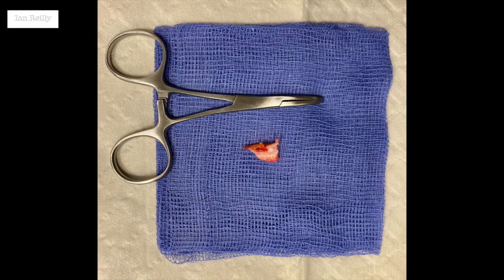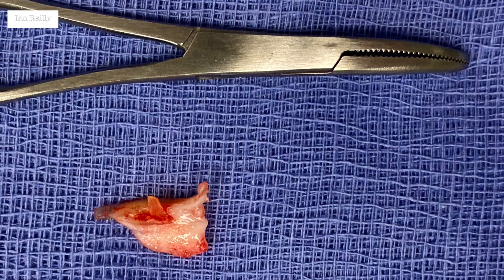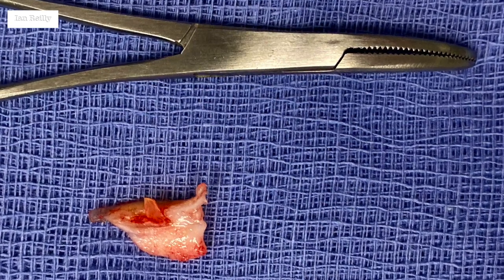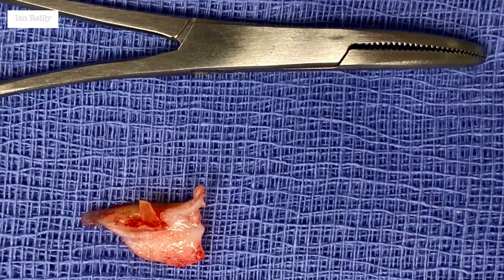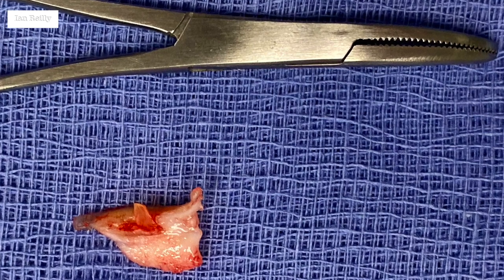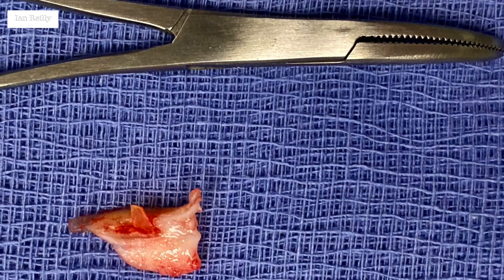Here's a section of nail. The spicule of nail is at the top as you look at that section and the matrix is at the bottom. You can see that's an elliptical excision but in 3D — there's quite a depth of lesion, for want of a better term — and that's what you often find with these. Actually the matrix is a little bit bigger than you think — a little bit difficult to get in really with a Q-tip to do the phenol. So this Winograd type spiculectomy I think is a good option. That's the section that came out in one piece, and of course you'll see I went in sharply and with the curette to take out anything that was suspicious.